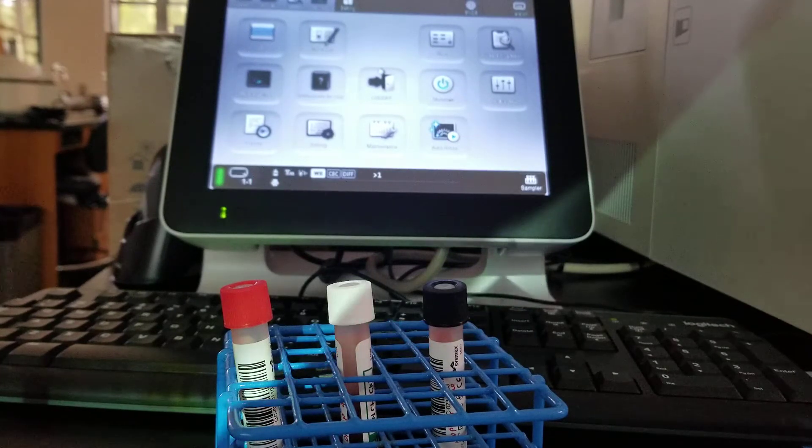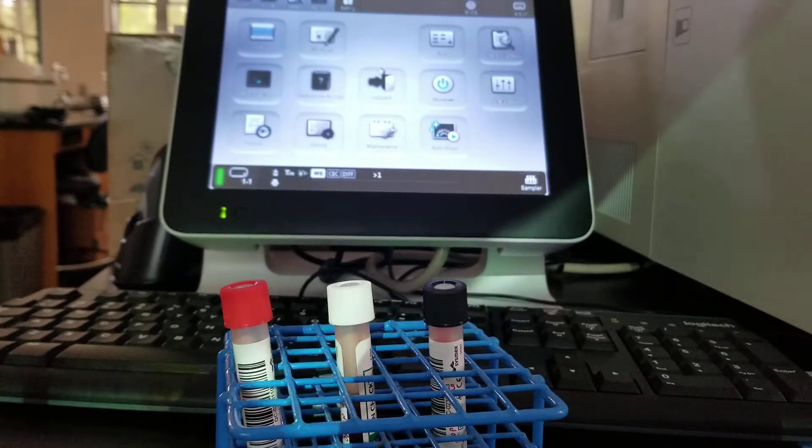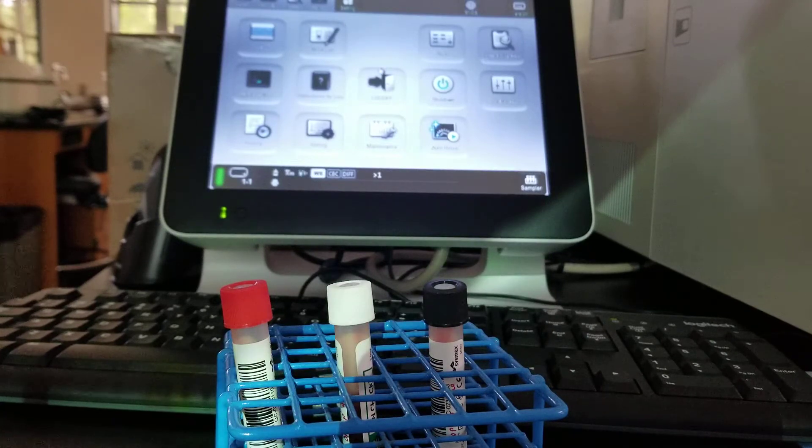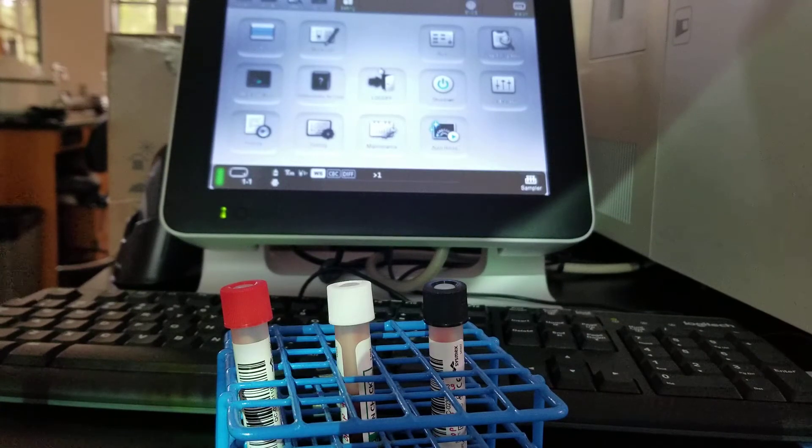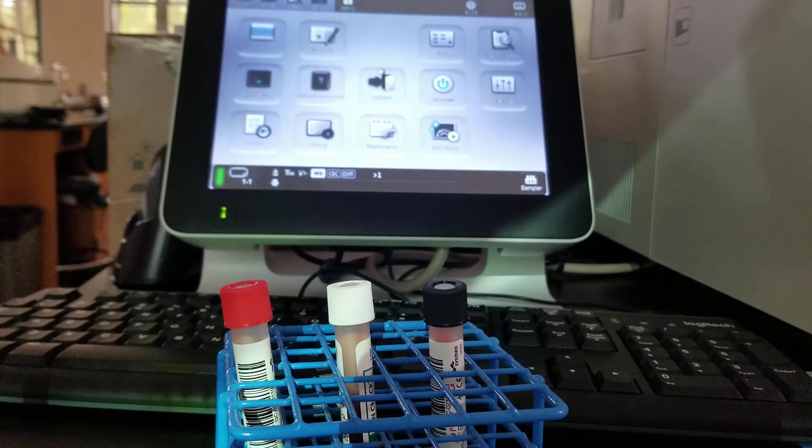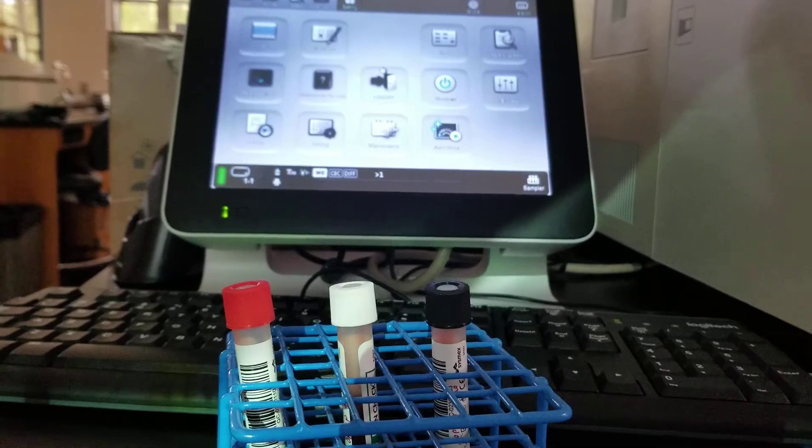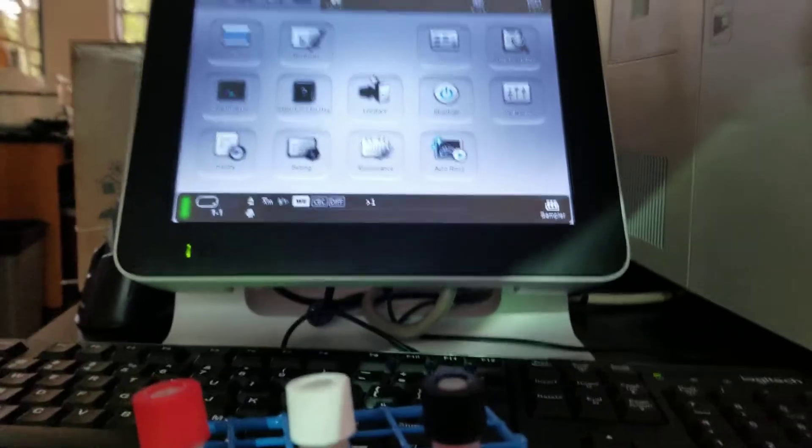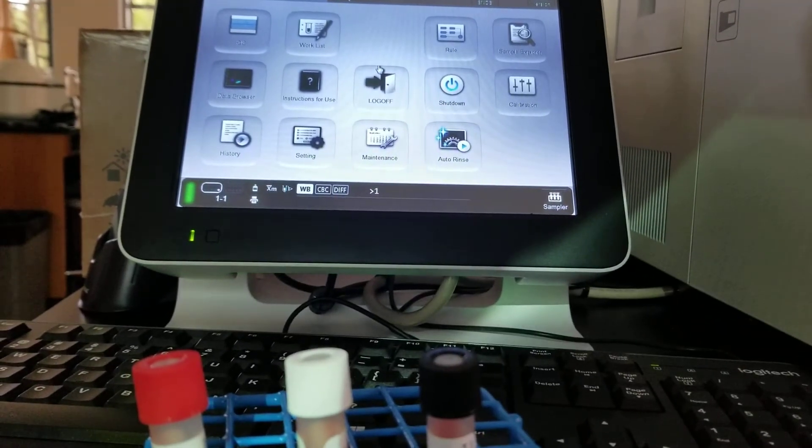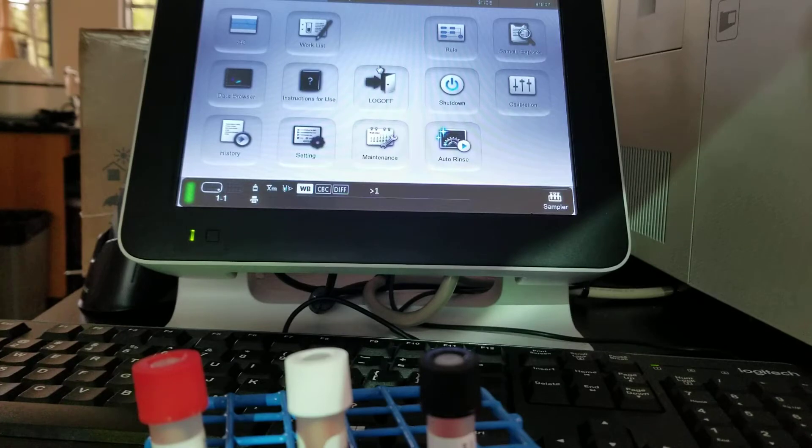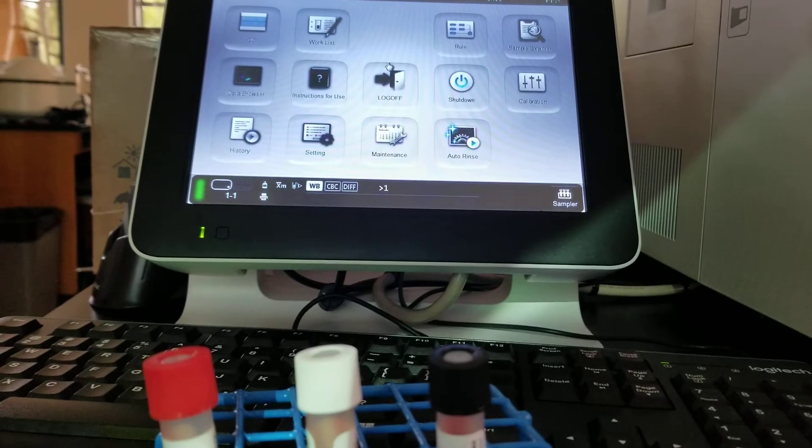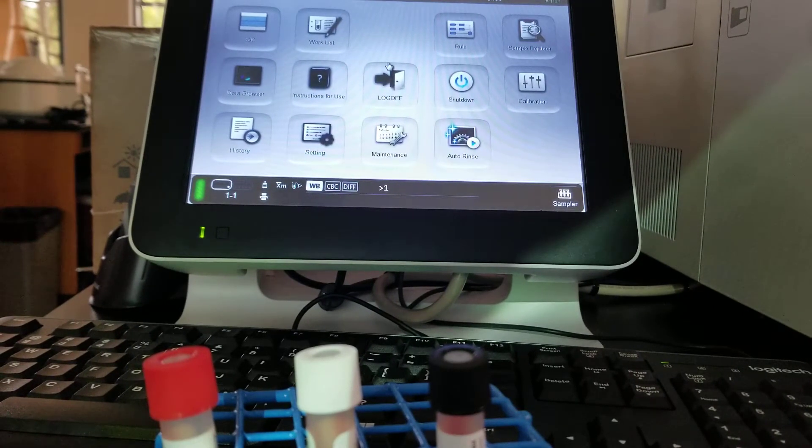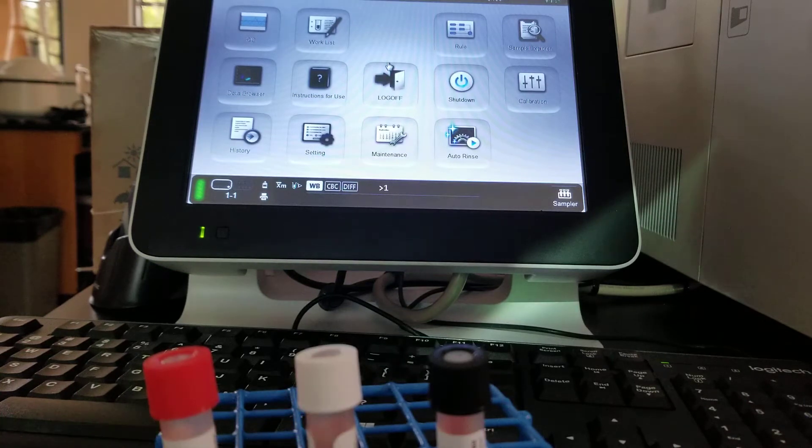It did not flag us to do the cell clean auto like I was hoping it was going to, but we're going to do it to make sure our analyzer is running really well. At the end of class, you do this procedure also. It's part of your daily maintenance that you're going to do.